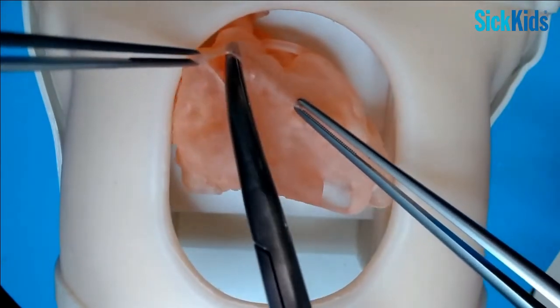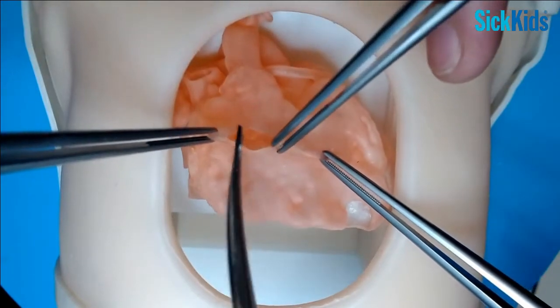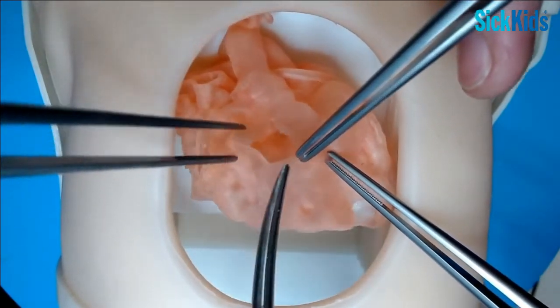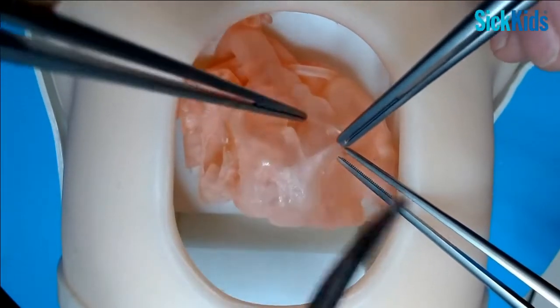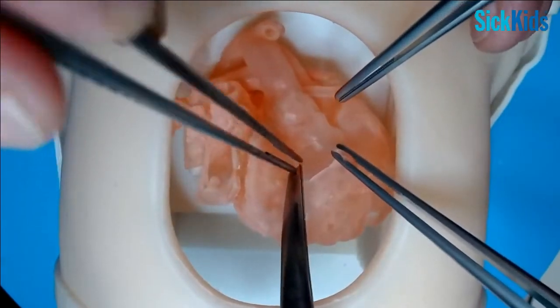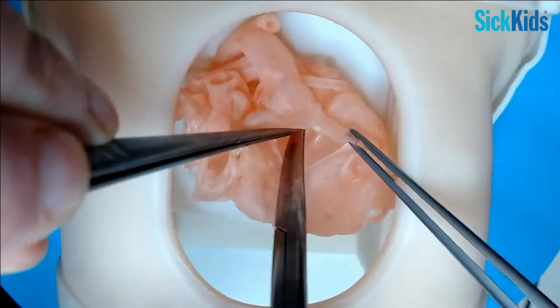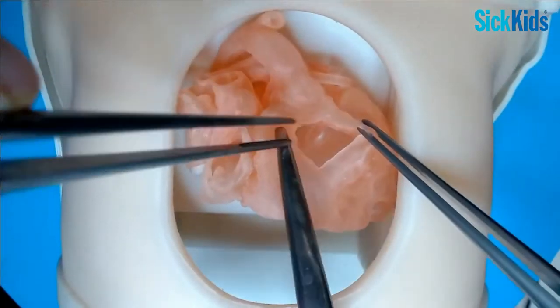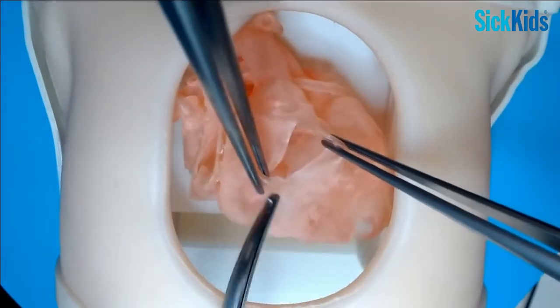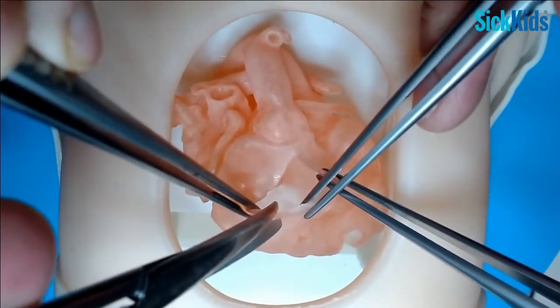You can look up inside - you're looking for the leaflets of the valve. We can come a little bit further up, and immediately you can see you're getting a much better appreciation of the VSD, which is down here. I think that would normally be certainly all you would need in terms of ventriculotomy.